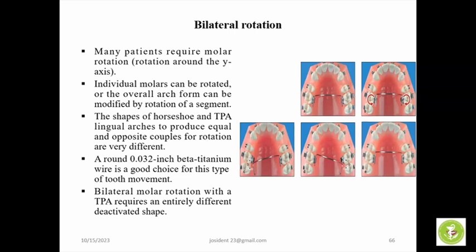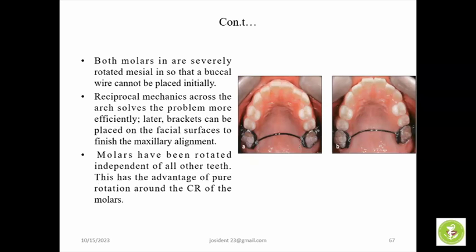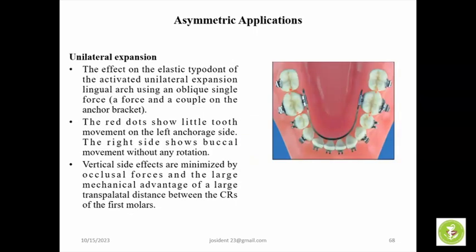Similarly, testing the placement, you could do so many miracles with the lingual arch. And this is a very good advantage of using lingual arches as an accessory component. And the other one is in the case of unilateral expansion, means using one segment as an anchor unit and the other segment as an active component. You can apply force to one side, which is asymmetric force application. So you could receive a stronger anchorage from one side to displace a single tooth on the other side. So that's a sort of asymmetric force application or asymmetric expansion.